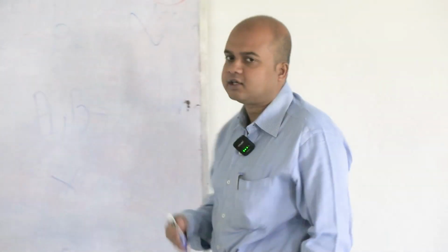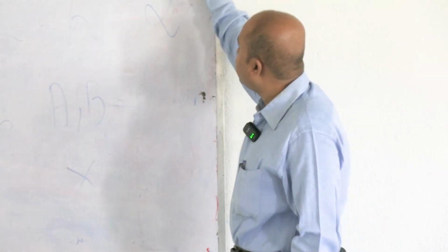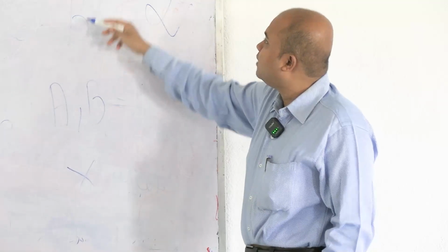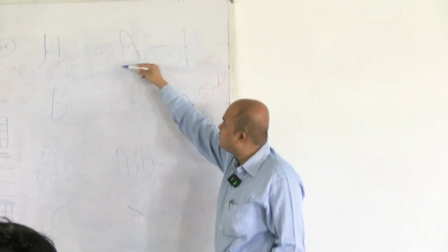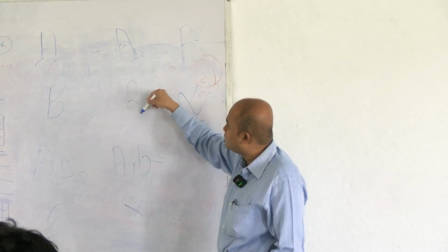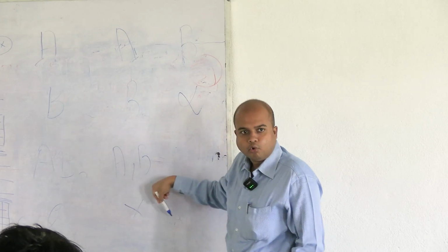These will be taught under blood groups, the hazards of mismatched blood transfusion. This is a theoretical aspect. So today, for doing the experiment, what we need to know is that A type contains A and beta, B type contains B and alpha, but for this we need only the agglutinogen. A contains A type of agglutinogen, B contains B type of agglutinogen, AB contains A and B both, O contains nothing.